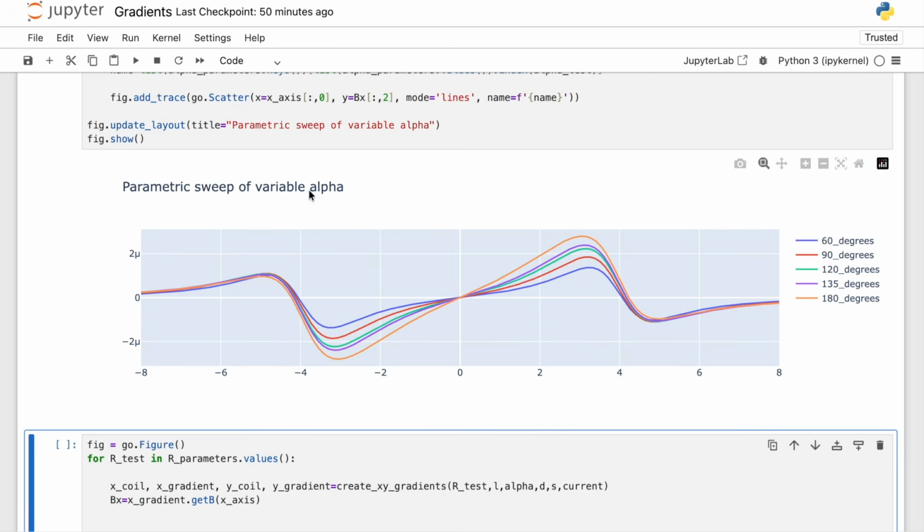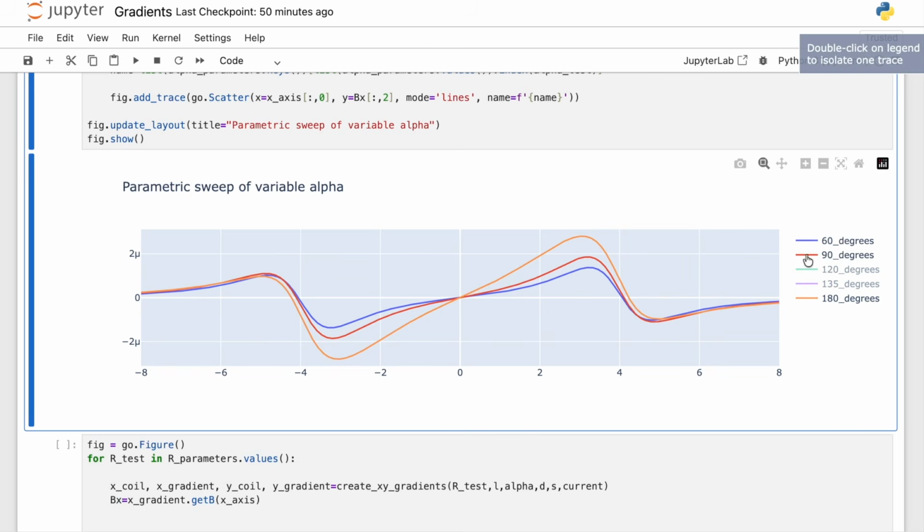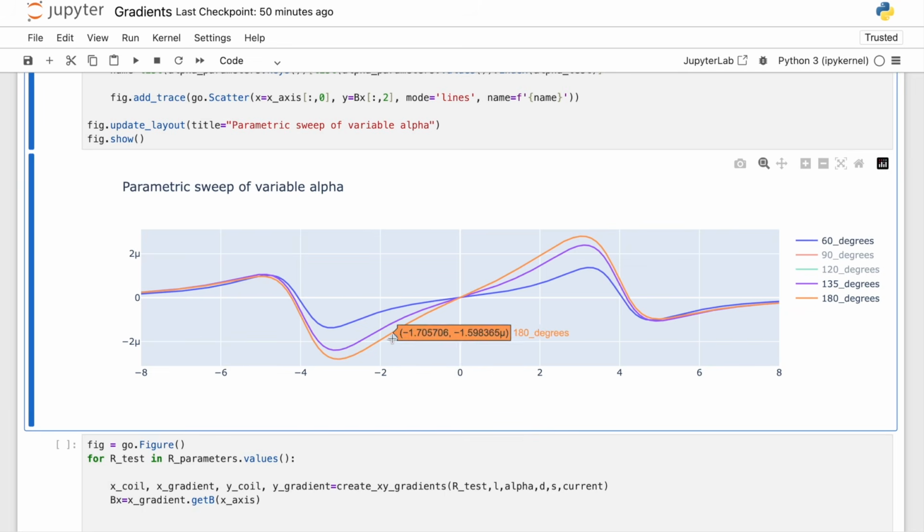So here we see our graph, parametric sweep of variable alpha. And for example, here we can see that by increasing alpha, we get stronger fields. So I can leave only 180 degrees, and vice versa. Like the smallest alpha resulted in the weakest field. And also it's important to note that here we also lose on linearity. Linearity is also really important for gradient coils. We didn't cover it much yet, but it's important. So here we can see that 180 degrees configuration or 135 degrees configuration creates a more linear curve than 60 degrees. So these two would be favored.